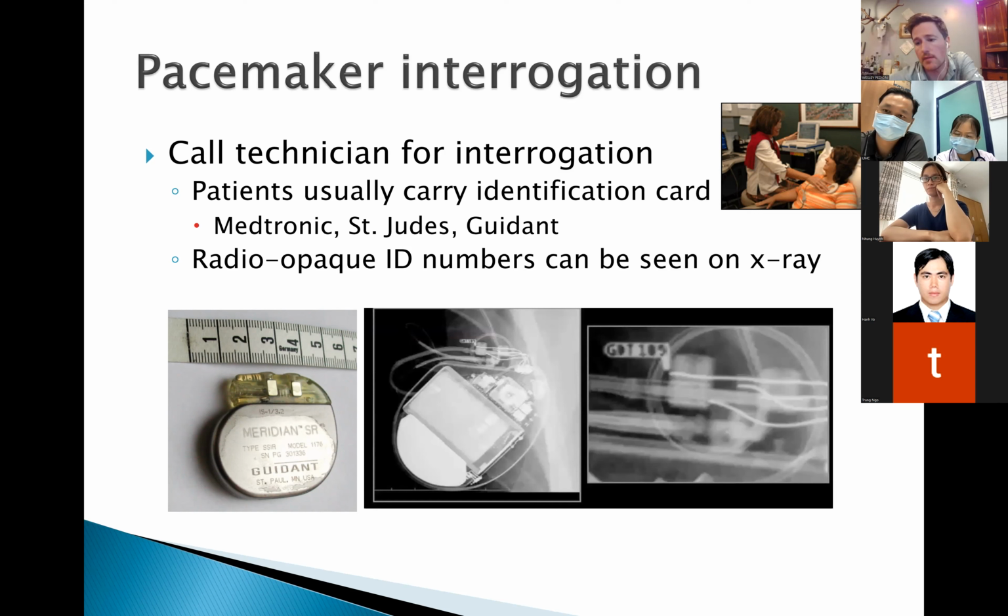You guys know what I mean by pacemaker interrogation. They come down and run some diagnostics on the pacemaker and see what kind of rhythms they've been in, see what's been going on. Do they come down and do that for you guys, or do you have to call in someone else?